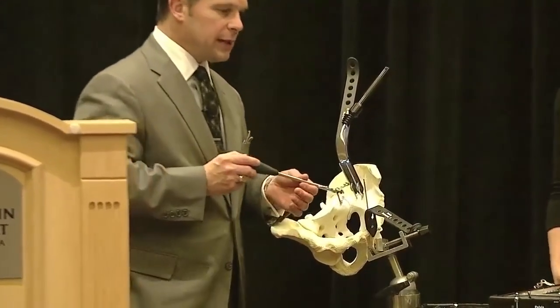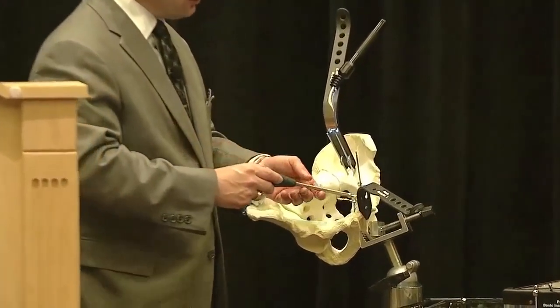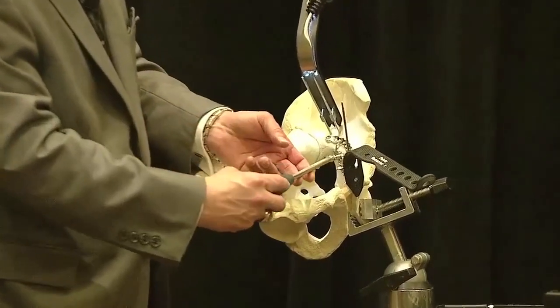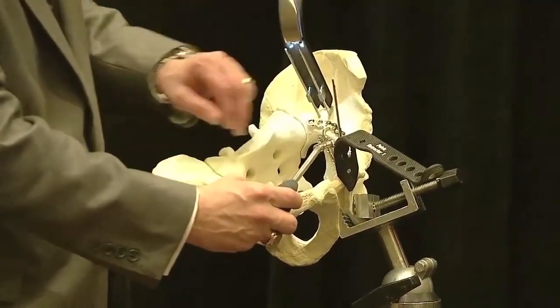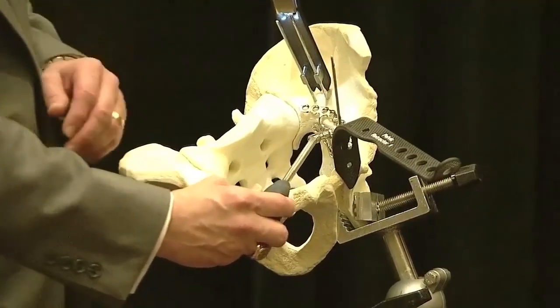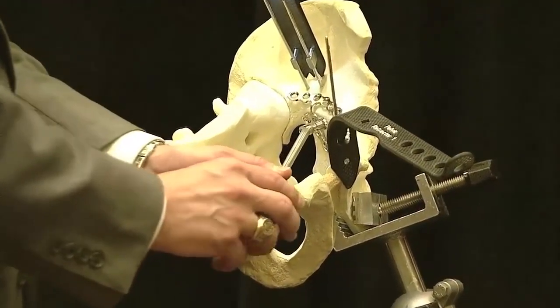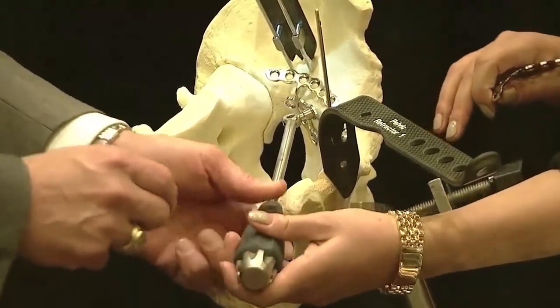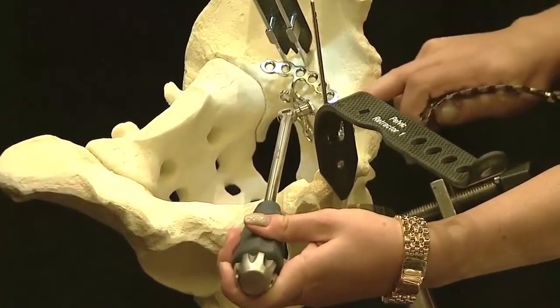And Claude will show you in the cadaver, but we put this in the wound. In this particular plate, you have to be very careful of the nerve. It has to go behind the nerve and back to the back, and you can see it's fairly nicely contoured, and I can get it in place, again, with either myself or someone holding that for me. Karen, do you mind being the assistant and holding? You can see you can put the plate in pretty good position.